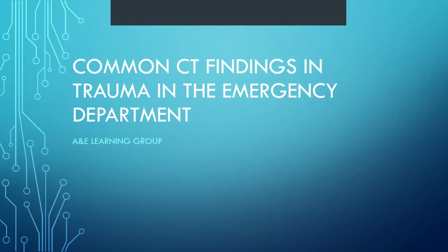So what I wanted to discuss today was common CT findings in trauma that we normally see in the emergency department. Now, this particular session is really aimed at those of our juniors who maybe don't have much experience in radiology and in reading CTs, and especially those who may be working in rural and semi-rural areas, such as here in South Africa, where in our public health service, there's a great shortage of specialists.